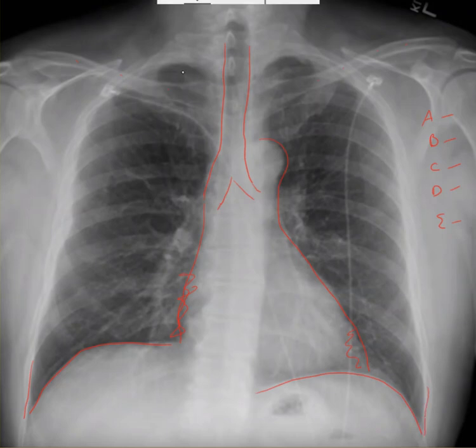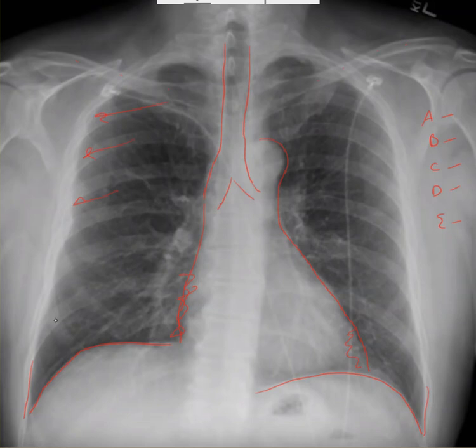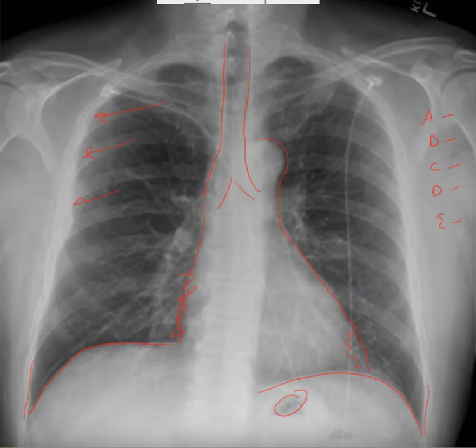E for everything else: make sure the pleura goes all the way out, which it does. Lung markings — vascular markings go all the way out; look at that on both sides. Look at your markings inside the lungs in general. Make sure there are no air bronchograms, cuffing, etc. This is a normal chest x-ray — that's your gastric bubble. Take that systematic approach every time you read a chest x-ray; otherwise you will miss things. Some people read in patterns, but I find I miss more if I just do patterns.